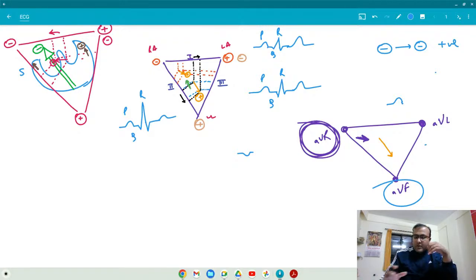The P wave, the upper arrow, the purple arrow. So is the purple arrow moving towards it or away from it? Positive deflection, negative deflection. Simple. Listen to the component, towards you, that's it. So positive reflection and negative reflection, where is the angle? Where the negative charge is coming from, that is the complication. I am not trying to complicate it, I am keeping it very simple.